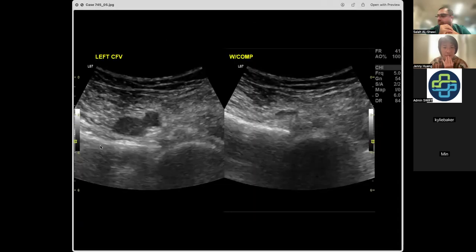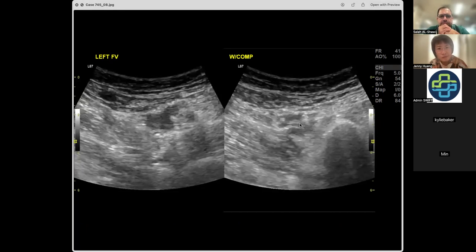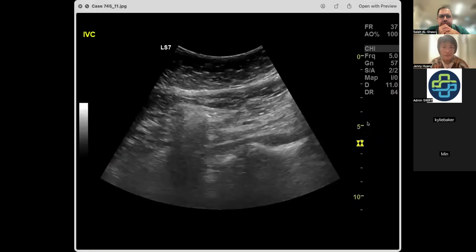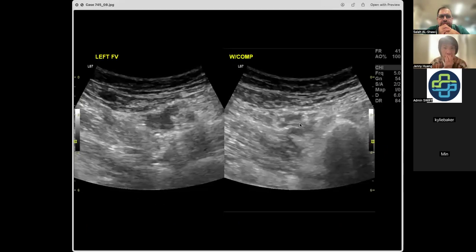So what's interesting is when we did the compression, it all fully compressed. I don't want to show you those yet.